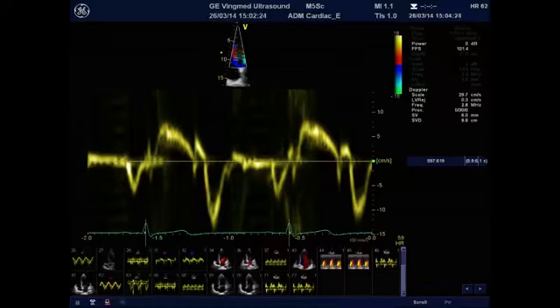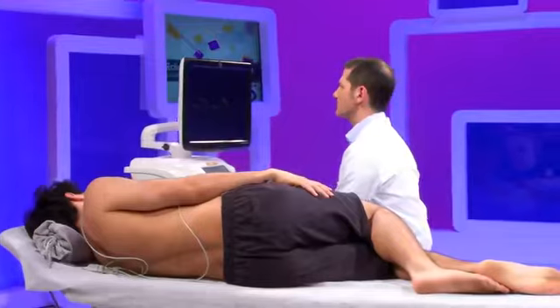Of course, the problem is that here we use a regional parameter trying to derive global information. And this may be tricky in patients who have a heterogeneous contraction or function of the ventricle.